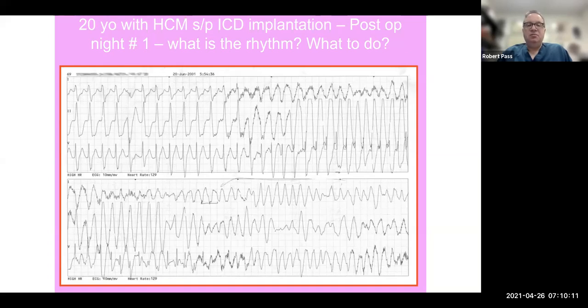So the other big benefit of a longer detection zone is that if a patient is in VF, they will be unconscious, in reference to your first question as to whether this patient would be conscious with this rhythm. Now, there's a fine line. The longer you're in VF, the harder it becomes to defibrillate somebody. That's been well established. So it's sort of a fine line between just enough to be unconscious, but not too long that it's harder to defibrillate the patient.